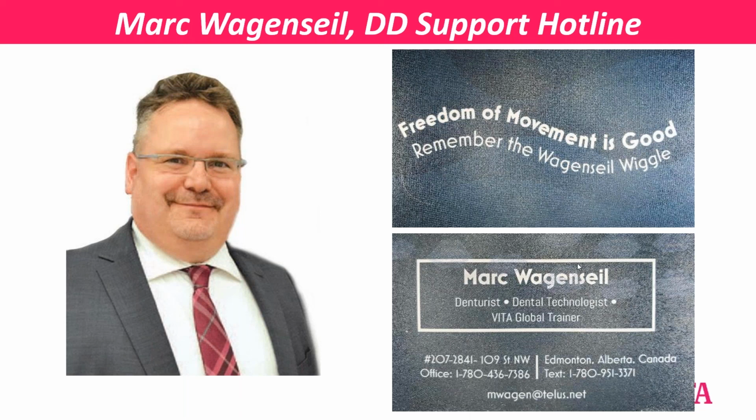All right, I think we're coming up on the last question. Do you set up usually a 1-to-1 or 1-to-2? So again, it's an indication-specific question, but 1-to-1. I'm a 1-to-1 dude. Yeah, because that's how the teeth are designed. It's more European, but yeah, you want the cusps over the fossa, so it's essentially 1-to-1. Absolutely. Yeah, it's been very effective for me.